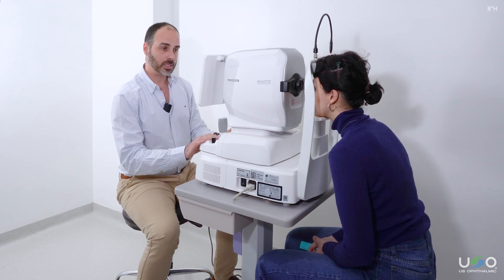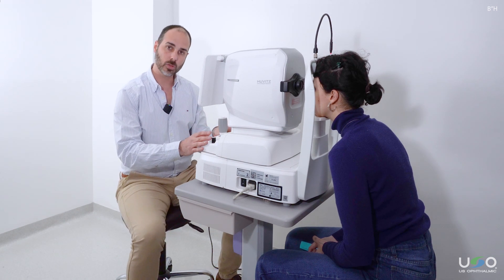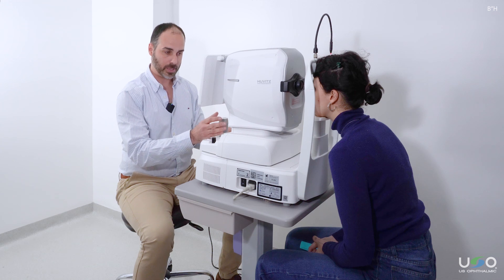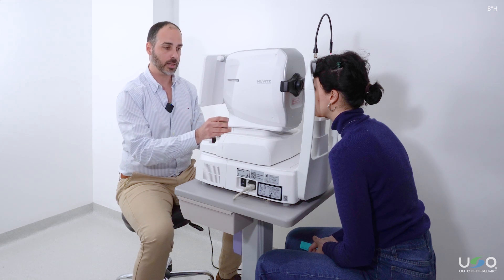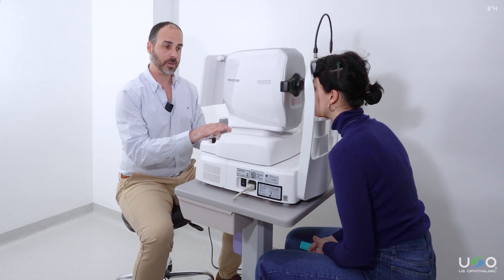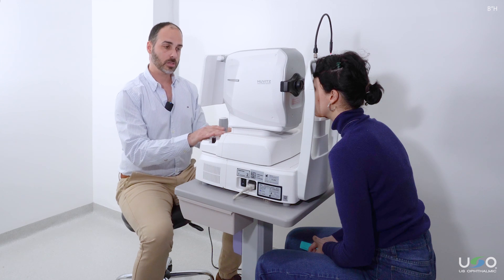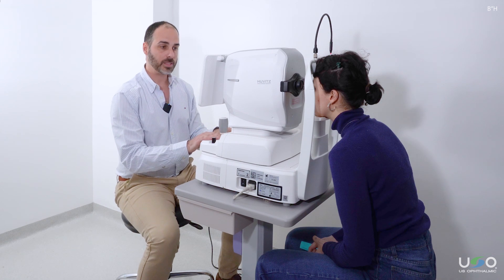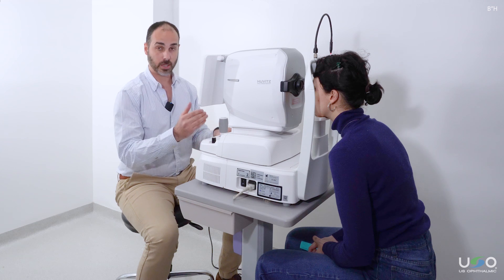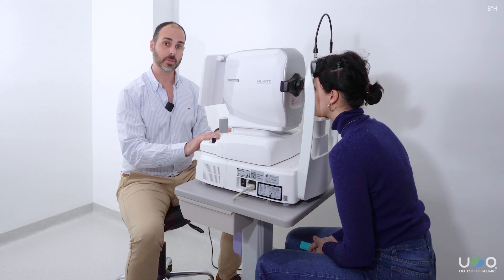Once we have everything set, the patient in position and ready to measure, it is important that we do not move the instrument and that the patient stays still. If for any reason the patient moved abruptly or withdrew from the position, we will repeat the measurement to ensure accurate results.